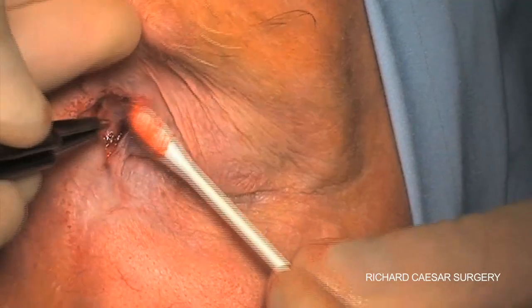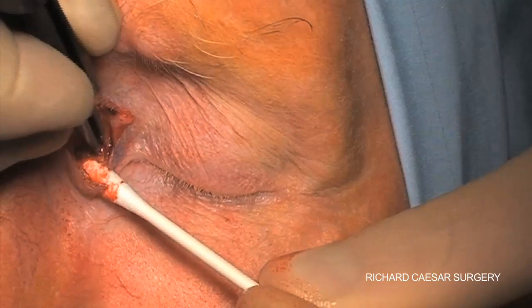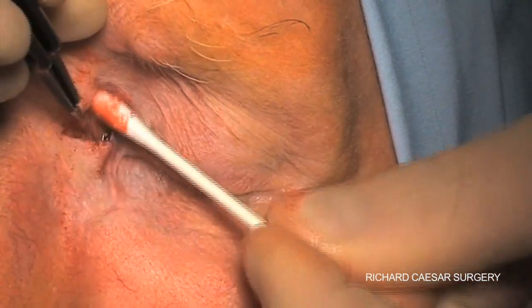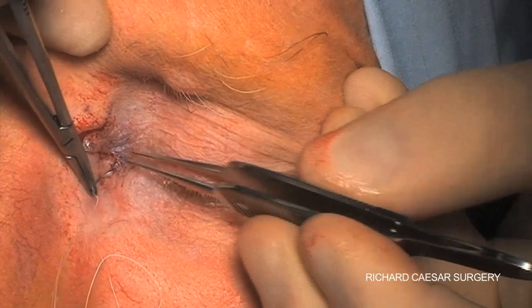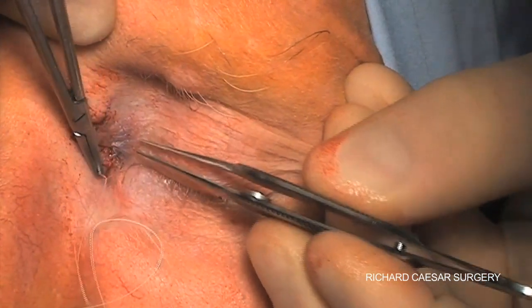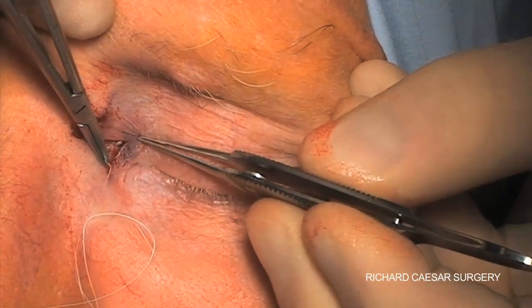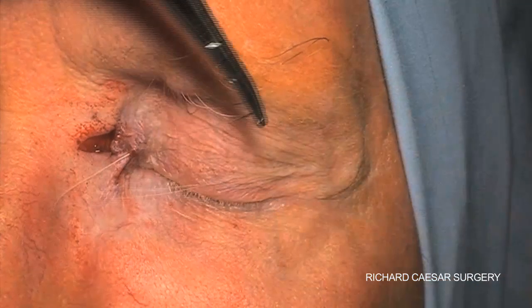A little cautery then gives a nice clean position from which to suture. To suture the Z-plasty, place the first two sutures at the refashioned corners.